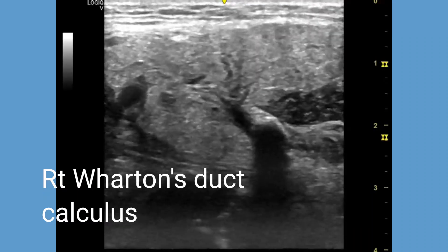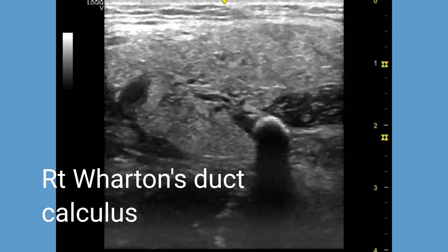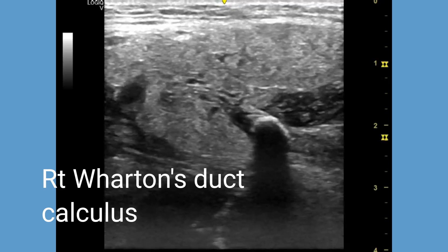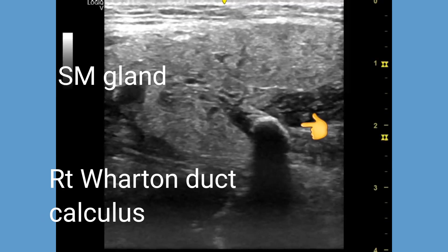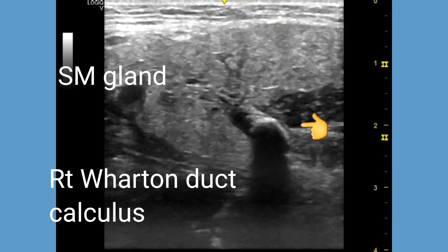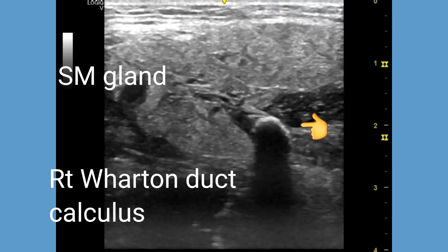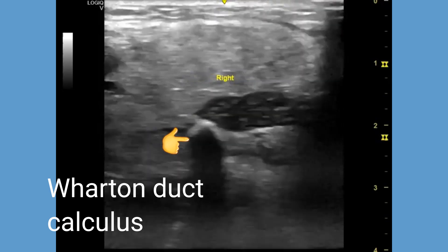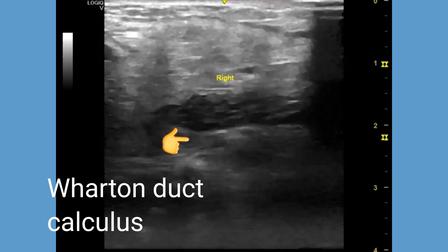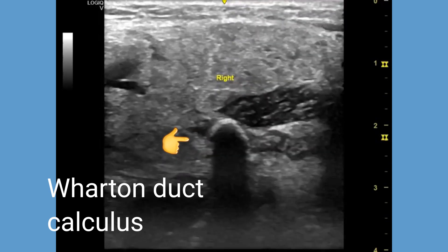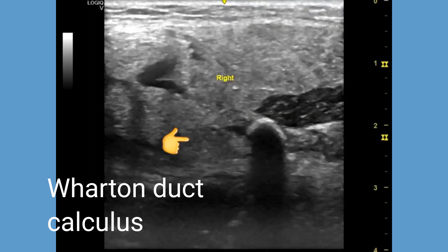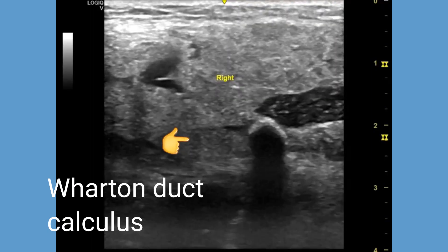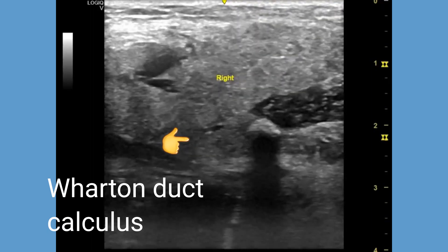In this video, we discuss the ultrasound imaging of a patient with a sub-mandibular duct or Wharton's duct calculus. The sub-mandibular duct or Wharton's duct is the tube that carries saliva from the sub-mandibular gland to the mouth. It is located under the tongue and runs along the floor of the mouth.